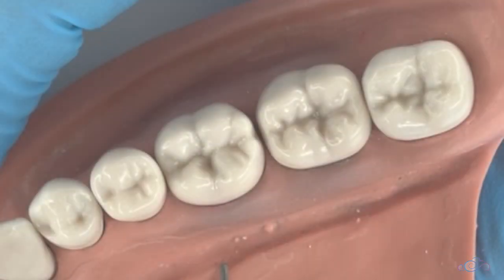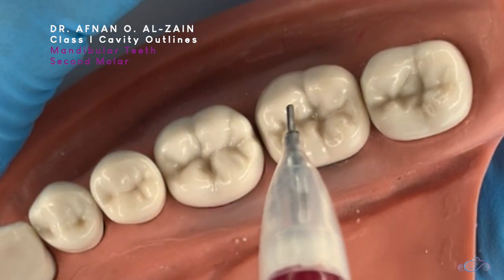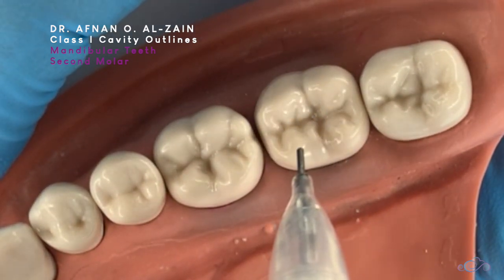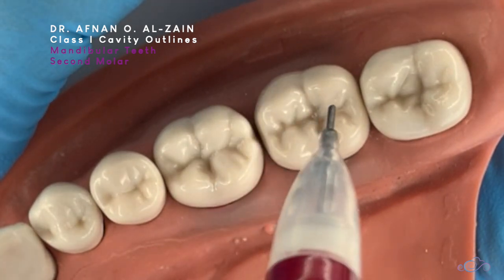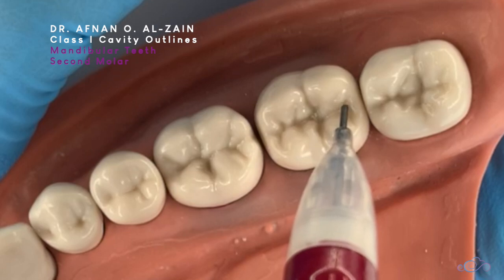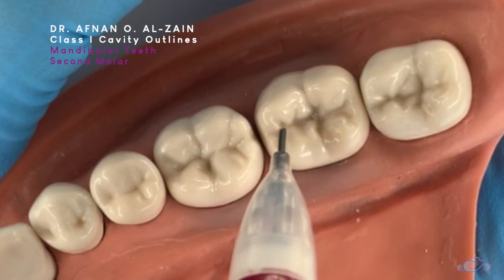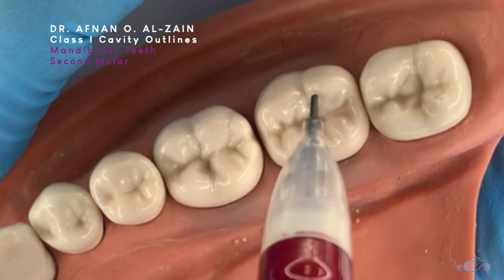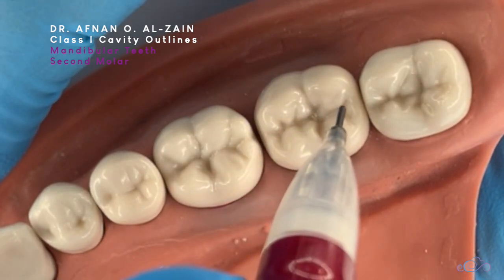We're going to start with the second molar, or tooth number seven according to the FDI tooth numbering system. The second molar has four cusps. We're going to start with the triangular fossa through the central groove to the other triangular fossa, so we're going to have a straight line and then go to the buccal and lingual.